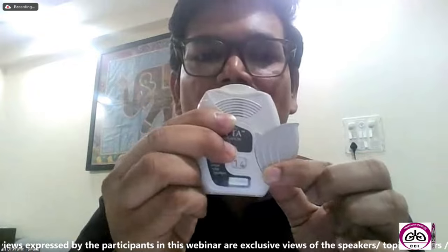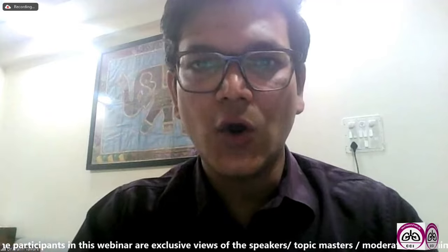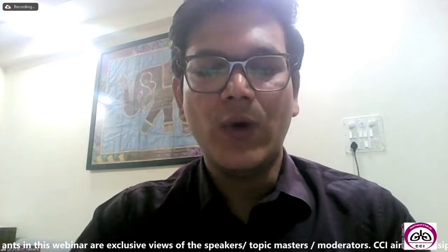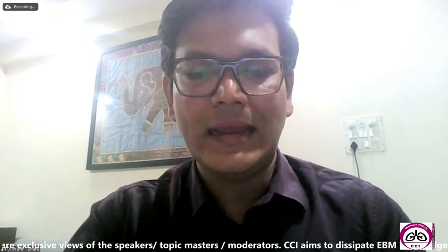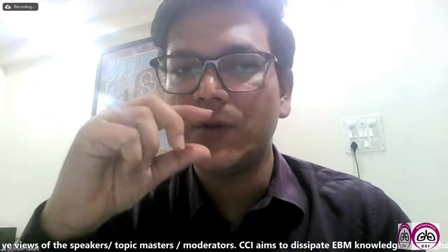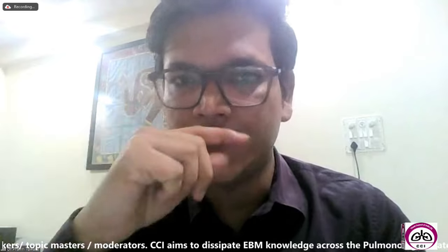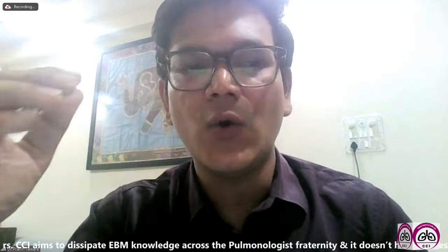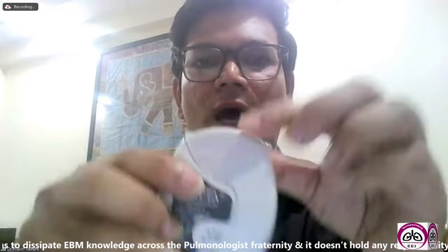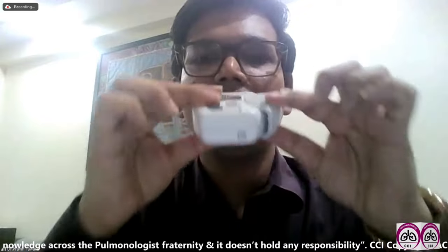Once you hear the click sound, the dose is loaded and you have to take initially a normal tidal breathing, and then breathe out completely and then inhale and hold the mouthpiece in between your lips and make sure the lips are tightly surrounding the mouthpiece, and inhale deeply and steadily, and then hold your breath. So I'll just show you how to take it. Once the drug is loaded, so you are hearing the click.